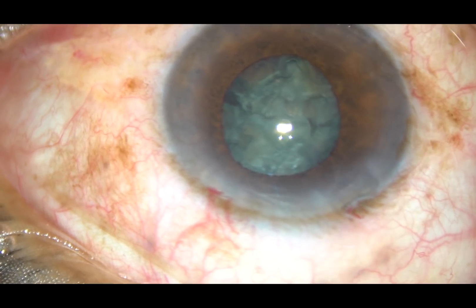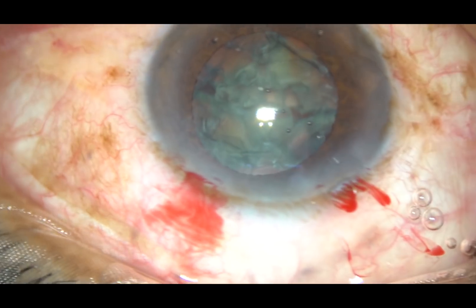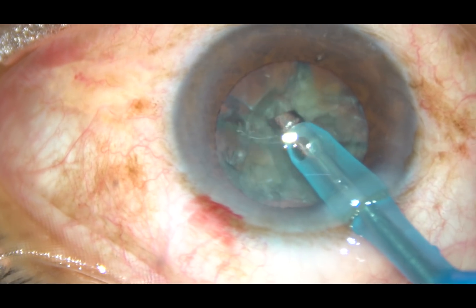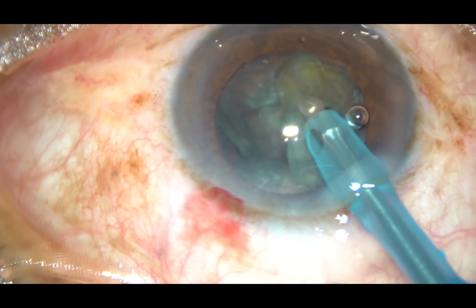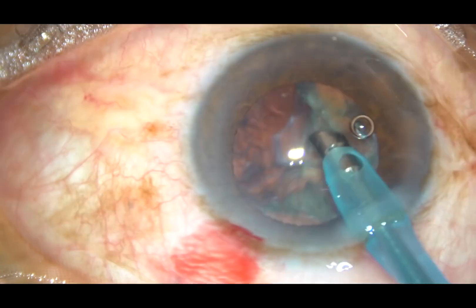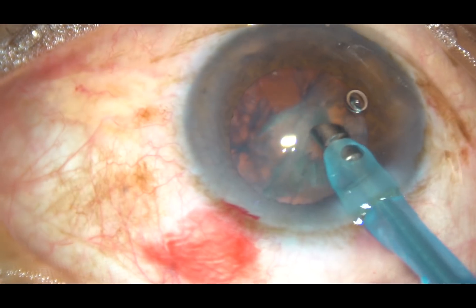I know that it will be very difficult to continue emulsification of the pieces if the pupil becomes so small. So here is my technique: I come out, reposition the iris, inject viscoelastic. I have chopped the nucleus into fragments, and now my plan is to emulsify the fragments single-handedly without using the chopper. Because if I introduce the chopper through the side port, again the iris will tend to prolapse through the side port. So here I go — I am emulsifying the nuclear fragments single-handedly.